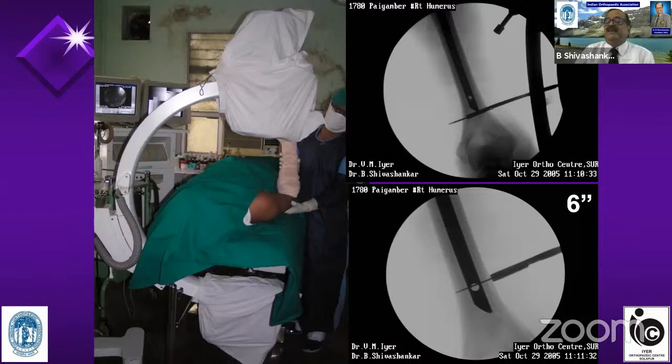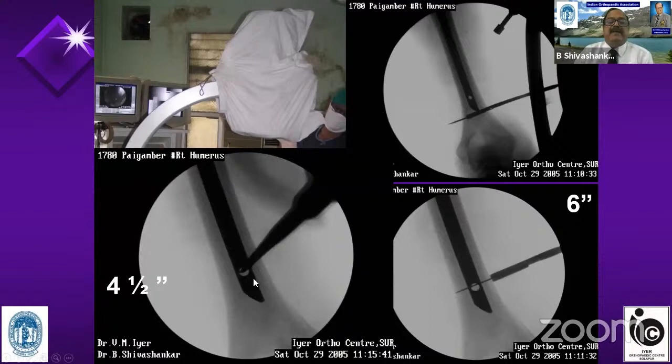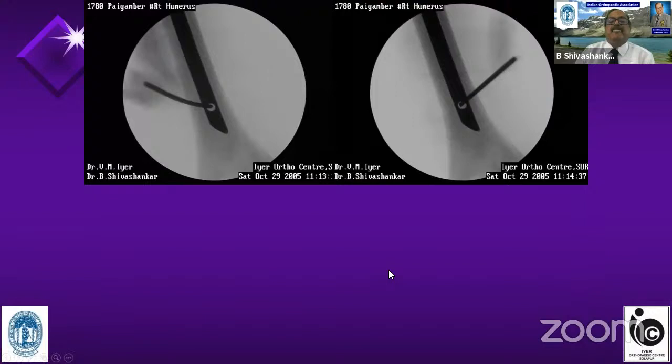Then use your C-arm judiciously. The C-arm can be kept in 9-inch mode, which doesn't show the distal locking properly. By switching to 6-inch mode, the hole can be better seen. In 4.5-inch mode, zooming can still be done.